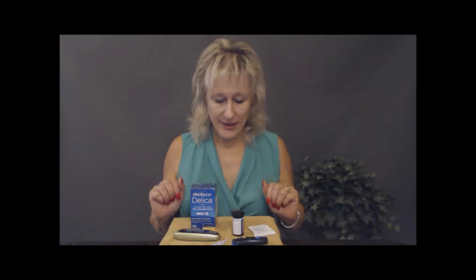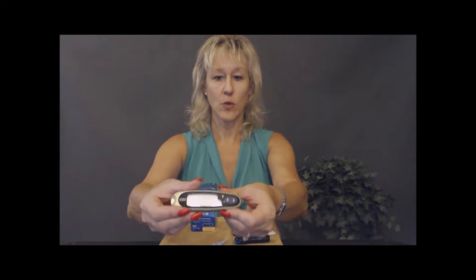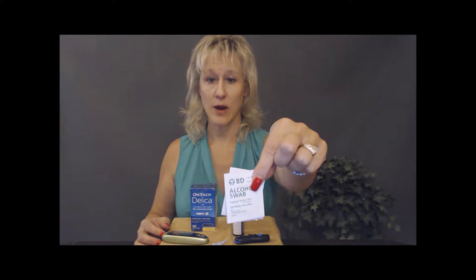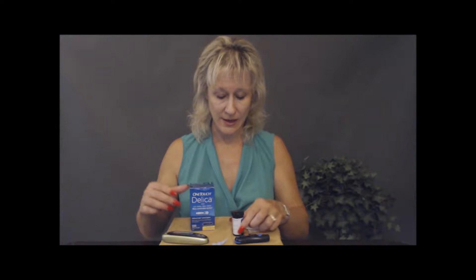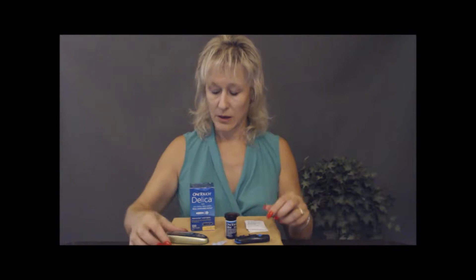So it's always about saving money where we can. Today I chose to use the Delica by OneTouch. We're going to use the OneTouch glucometer. Make sure you have alcohol swabs — these are cheap, you can get them at Walmart for about a buck a box. I'm using the Delica OneTouch needles for the lancet, and we have our glucose strips, also by OneTouch. Whatever brand you're using is fine — the basics are going to be all the same.